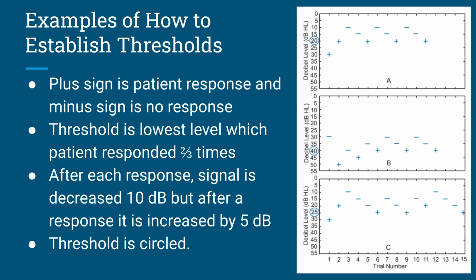The second ascending series ended with a second response at 20 dB and no response at 10 dB or 15 dB. However, there was still the possibility that 15 dB could be the threshold if the patient were to respond at 15 dB for 2 more ascending series to satisfy the criterion that the patient had the opportunity to obtain at least 50% of presentations out of a possible of 4 presentations. So it can be out of 4 as well.